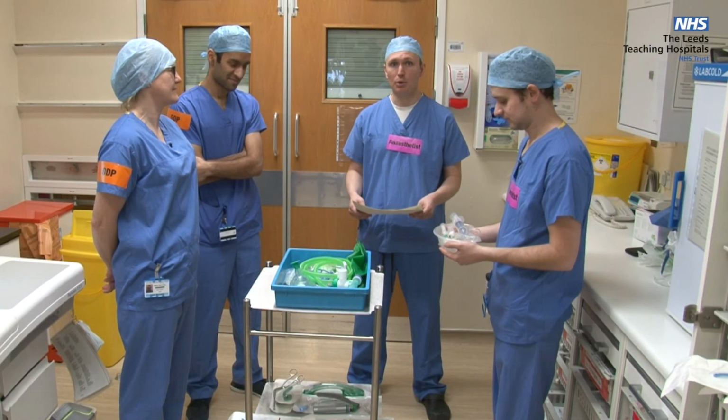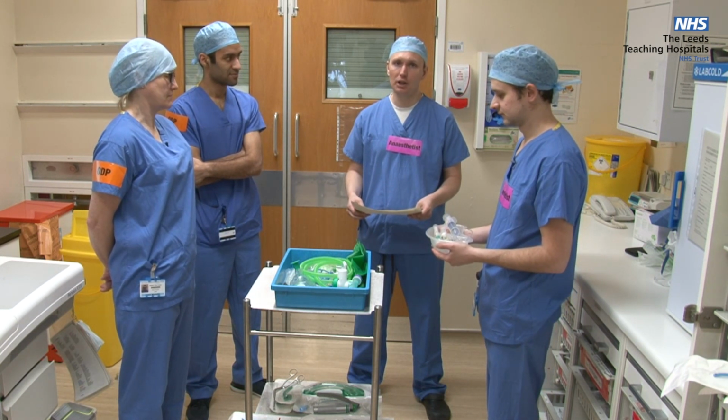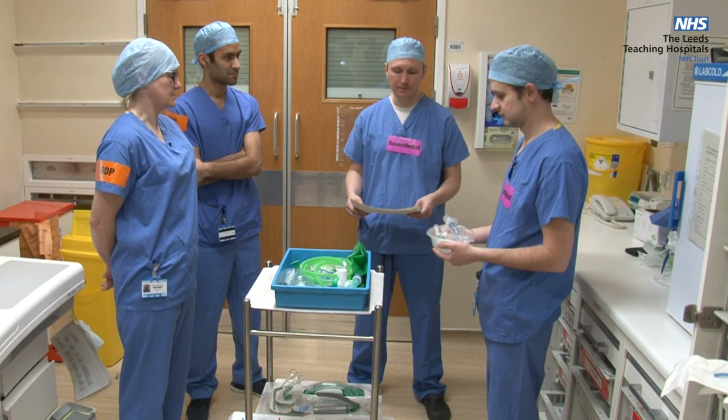So for this scenario, we have a 56-year-old gentleman who has been on the intensive care unit for a few days. However, the patient has deteriorated over the last 12 hours, and the team managing the patient has decided that they require intubation and invasive ventilation. Now, the intubating team is assembling outside the patient's room to begin the briefing. So all 4 members of the team would at this point be donned in their PPE as per the trust guidelines for an aerosol generating procedure.